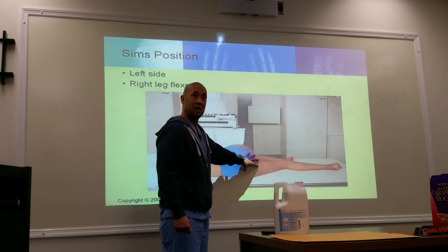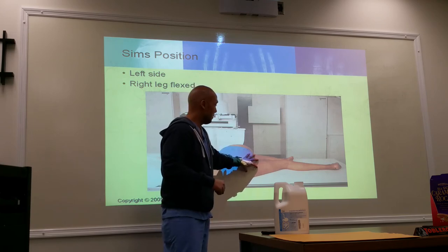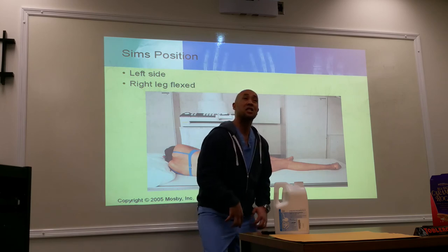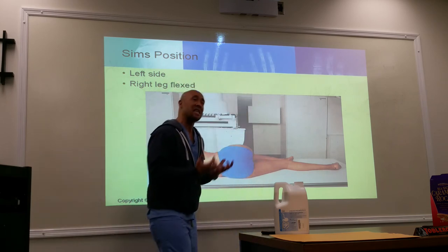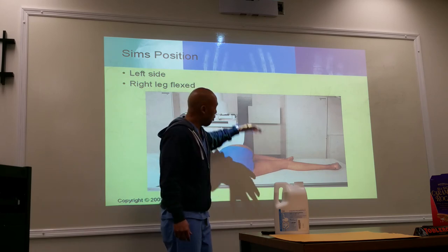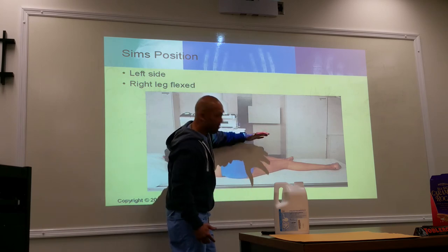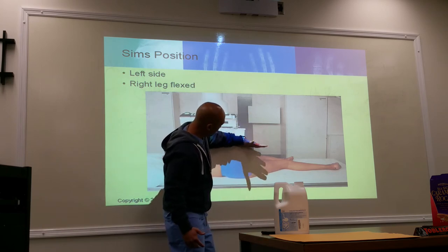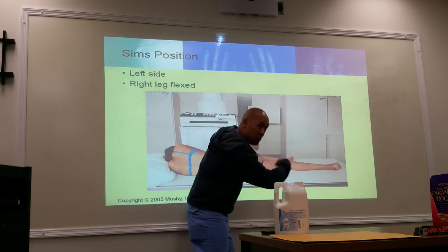Okay, you understand what I'm saying? And those holes are closely together. And if you're older, the skin isn't taut, it's loose. And if you have an obese patient, even still, it's hard to see over there. So when you're putting the tip in, you literally have to rest your arm on their hip. You're going to take your hand and pull their cheek up, cup it, and look.